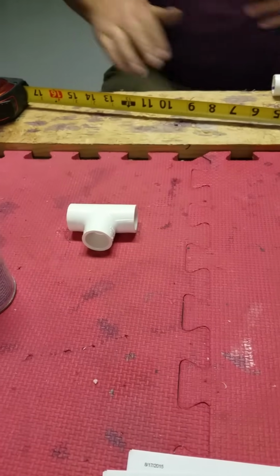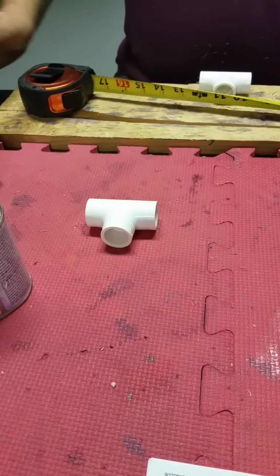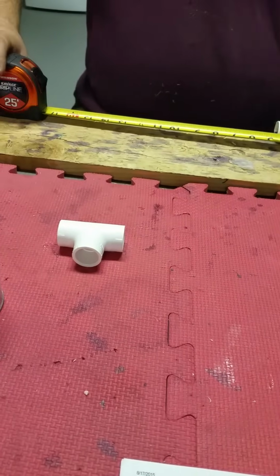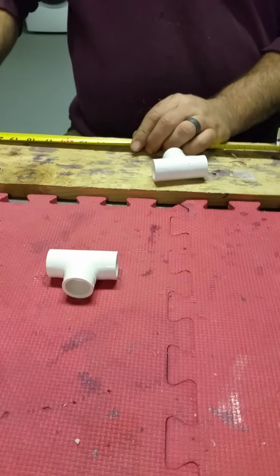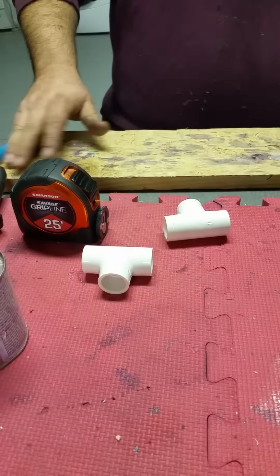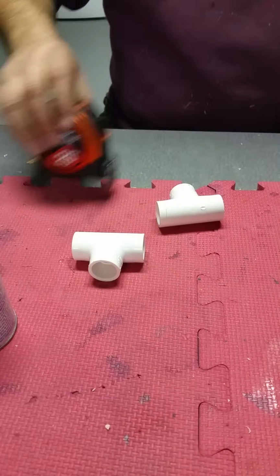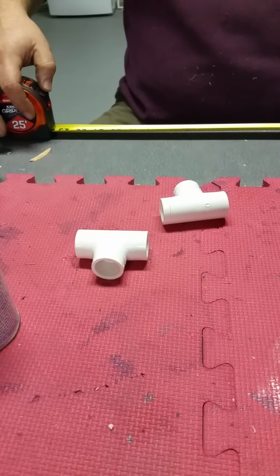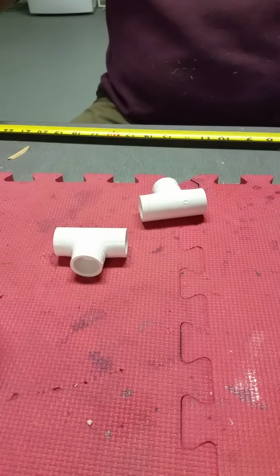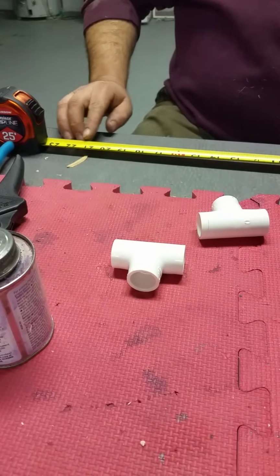The way that we've had you measure for the cart, the end of your measurement, which for this dog was 23.5 inches in length for the cart, ends at the center of the front shoulder. So we want to go back a little bit so that we're at the edge of the back of the front leg, and then at least 5 inches behind that, because they use their front legs still, so we need to give them room to have a stride there.